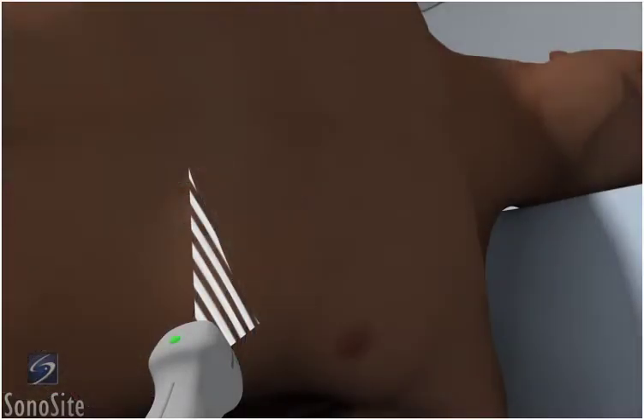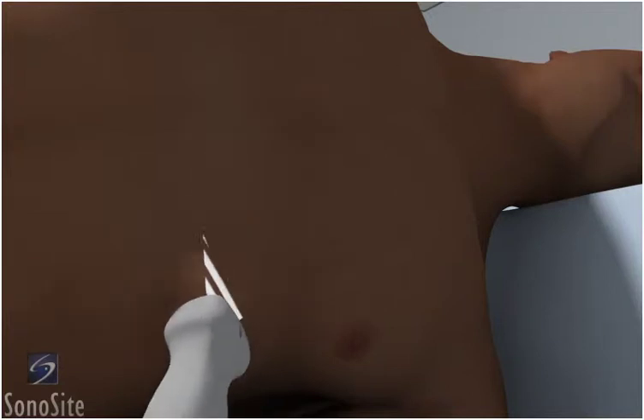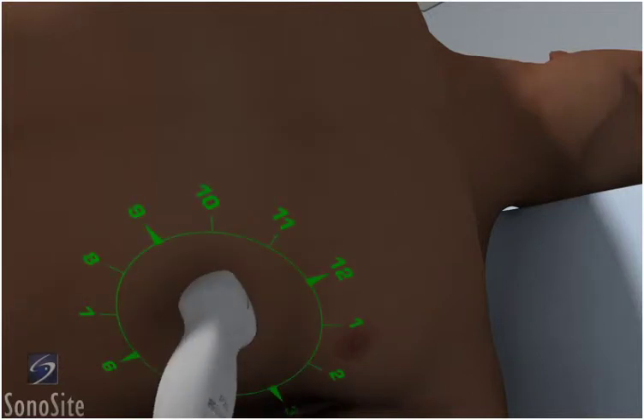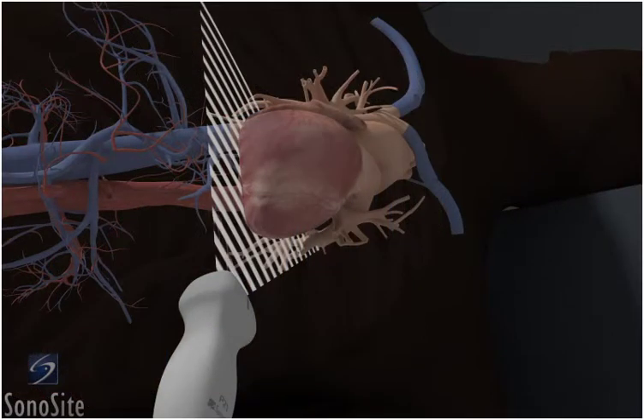Place the transducer at the apex or point of maximum impulse with the orientation marker to the patient's left side at a 3 o'clock position. As an alternative approach, this exam may be performed using an abdomen exam type with the orientation marker to the patient's right side.